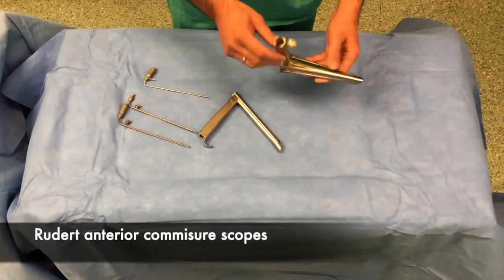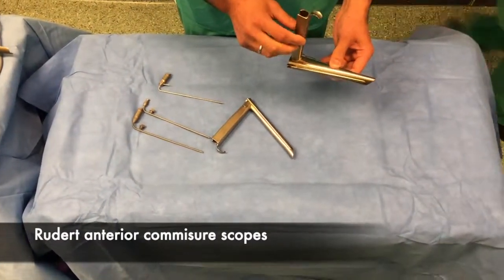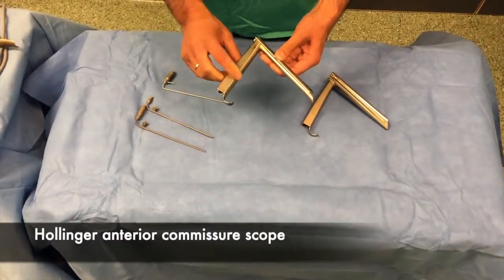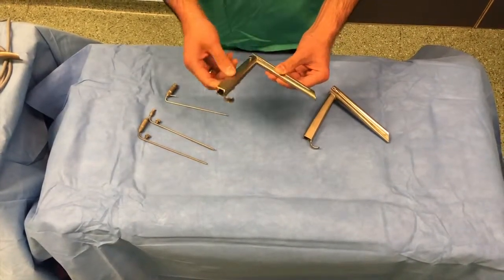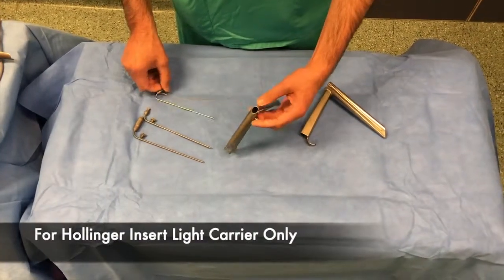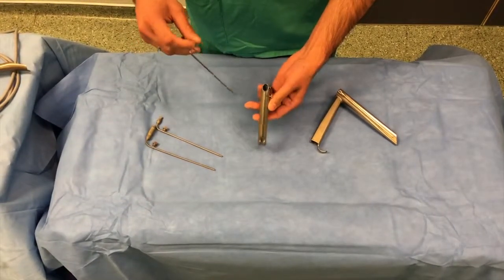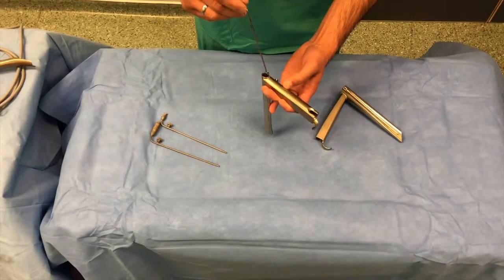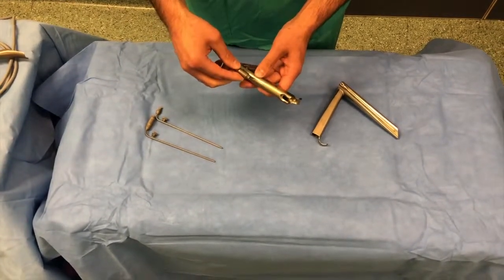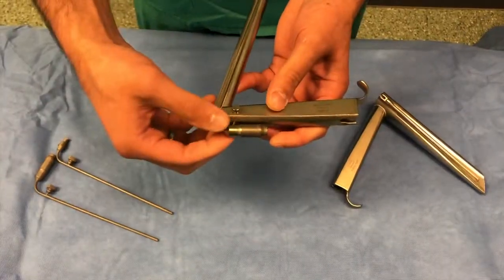This is the Ruddert Laryngoscope. This is the Hollinger Anterior Commissure Laryngoscope — the thinnest and narrowest laryngoscope in the set. It has a single port for insertion of a light carrier, which is inserted as shown in the video. Once clipped in place, it is screwed in to prevent any movement.